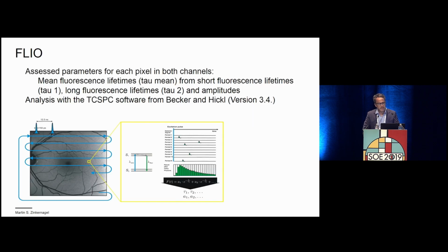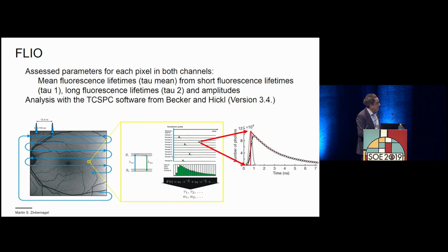The FLIO device scans the retina, and for each pixel, lifetimes are measured. These lifetimes are in the range of nanoseconds, so very, very short lifetimes.